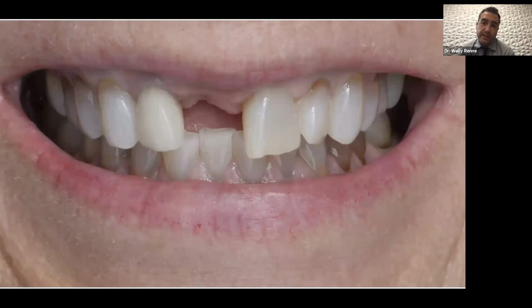This is a case that I wish I did. So this patient presented to me, and they are on chemotherapy. They're not able to get an implant right now, and they wanted to do something conservative restoratively. They didn't want something removable. So I'm like, okay, no problem. I'll just mill out a pontic with a wing and do a Maryland bridge or a resin retained fixed partial denture, if you will. And I did, and I bonded it in, I looked at it and I said, oh man, I did not pick up that there's a little bit of a tooth size discrepancy between that space and tooth number 9. And I feel kind of bad about it.